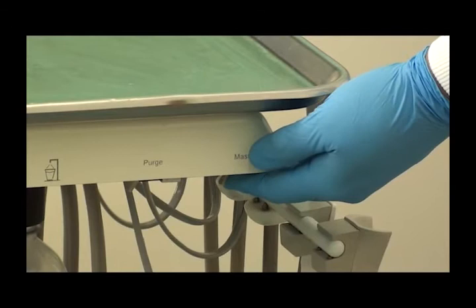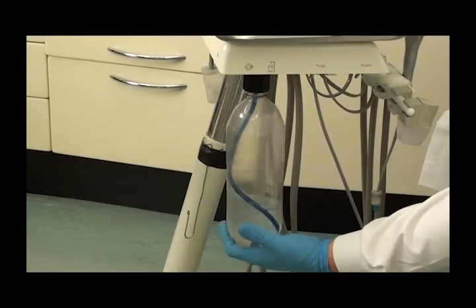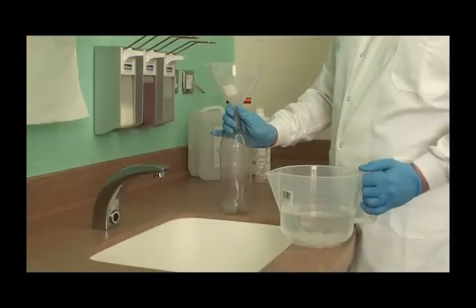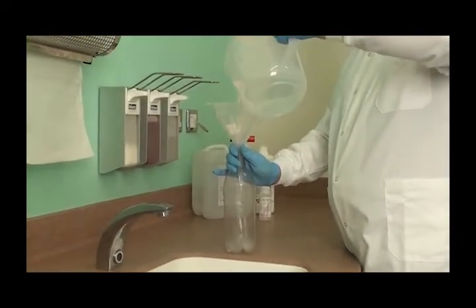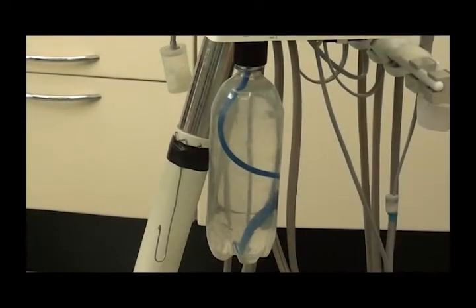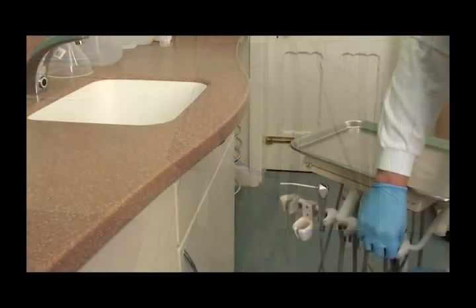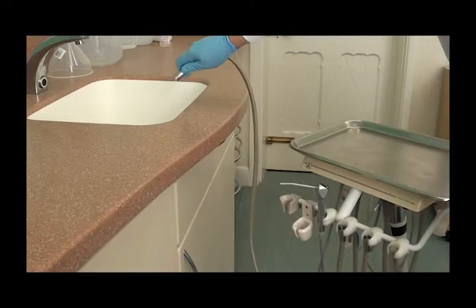Depressurise the bottle on the unit, remove it, and discard any contents. Rinse the bottle and fill with the hypochlorite solution. Reattach the bottle to the unit and repressurise. Operate the foot control to purge the hypochlorite solution through each outlet in turn.